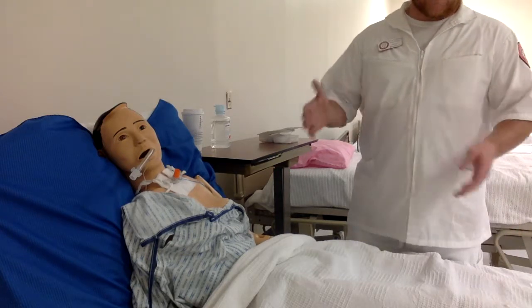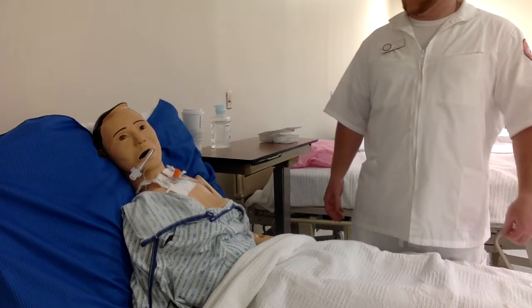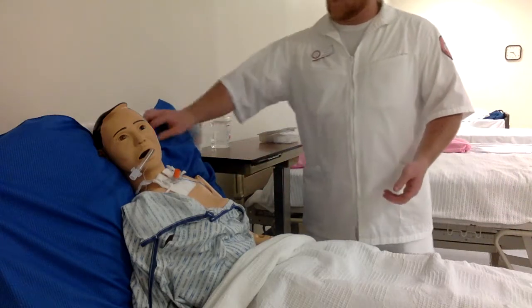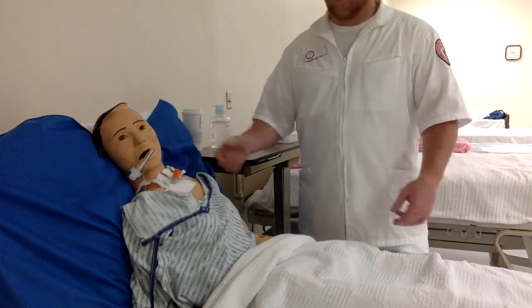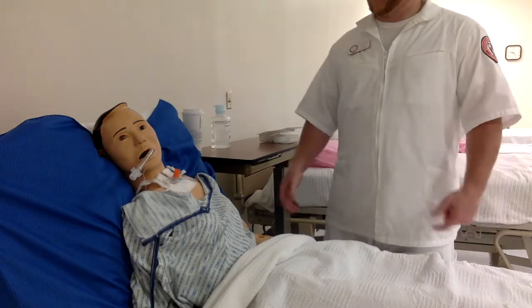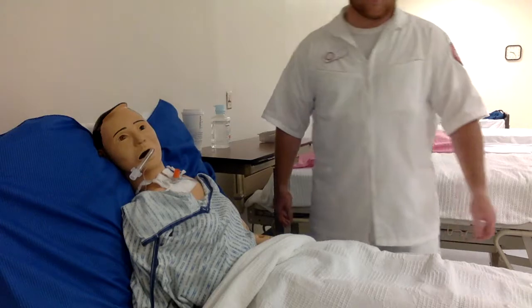We will then transition into the suctioning part. We want to make sure that the patient is in the semi-Fowler's position, unless contraindicated, but allow the patient to be in an upright position.